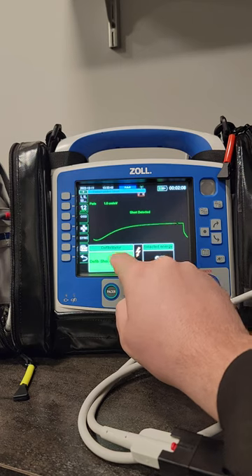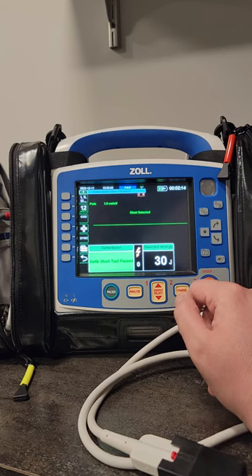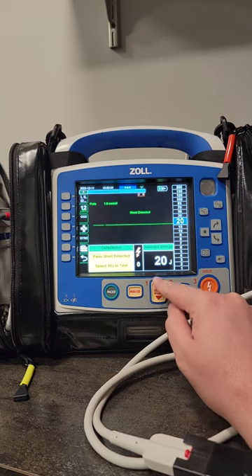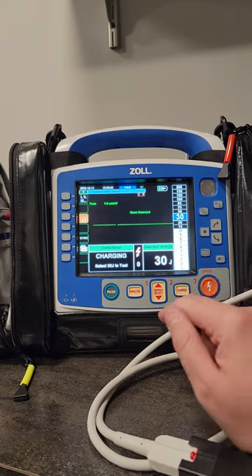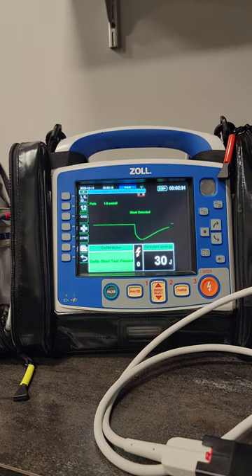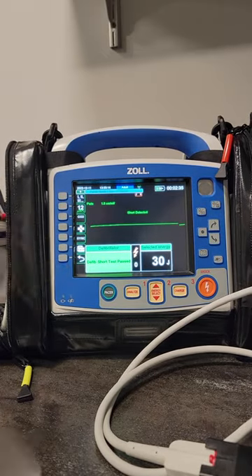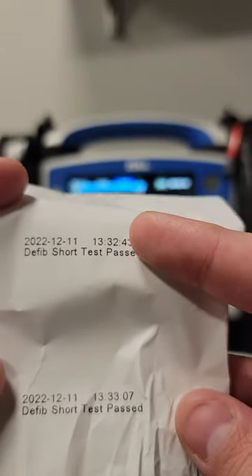It's going to say either pass or fail. So again, that's the energy select — go down to 30 joules, hit charge, it'll show charging, then shock delivered and passed. Then it'll print out on the printer showing whether it passed or failed and what time it did.